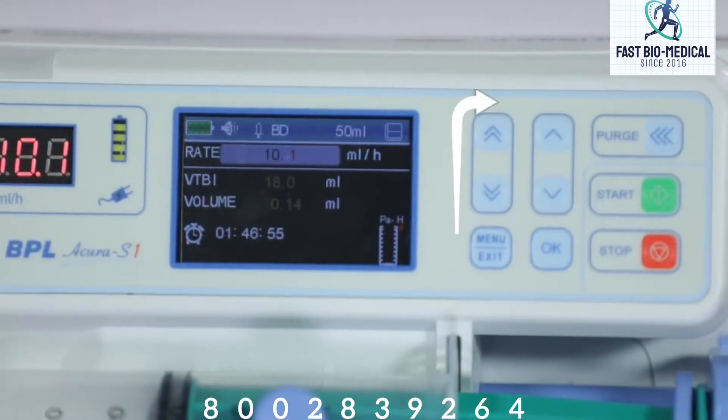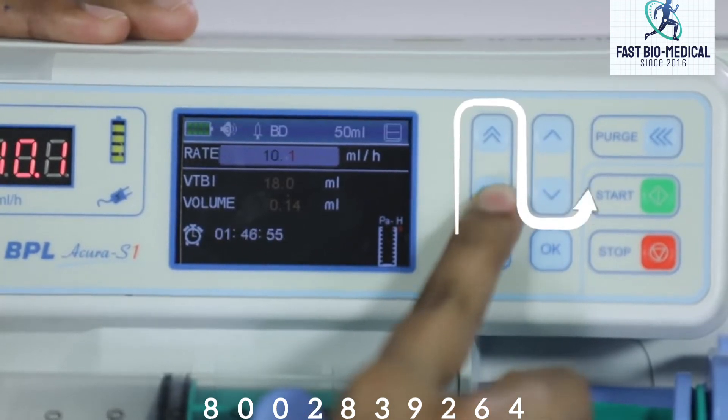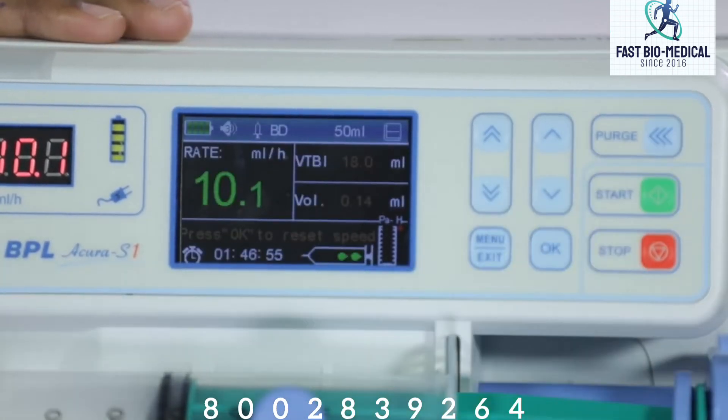The cursor will move circularly among the parameters. The incremental and decremental keys are used to adjust the parameters. After all parameters are confirmed, press the start button to start infusion.